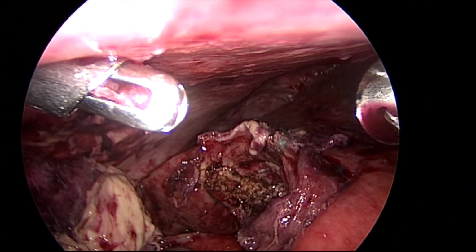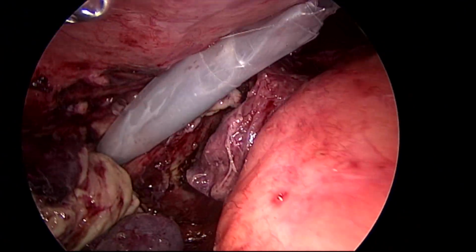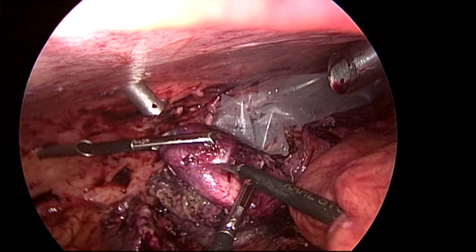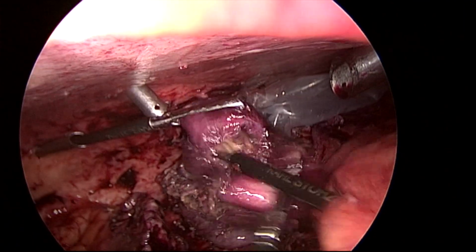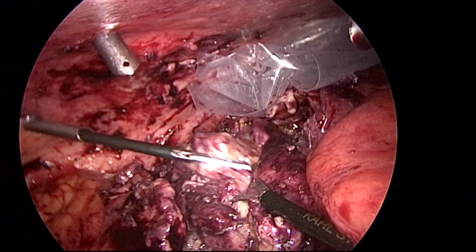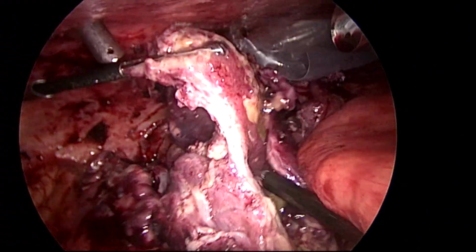So now the entire thing is done. I have to place the bag, a sterile plastic bag. So I'm placing the gallbladder into that. There is no space. Normally, in a previous case, if you see between the diaphragm and the liver, a lot of space will be there. I place the gallbladder into the endo bag, then I divide it into 3-4 pieces. Then I'll take it out.